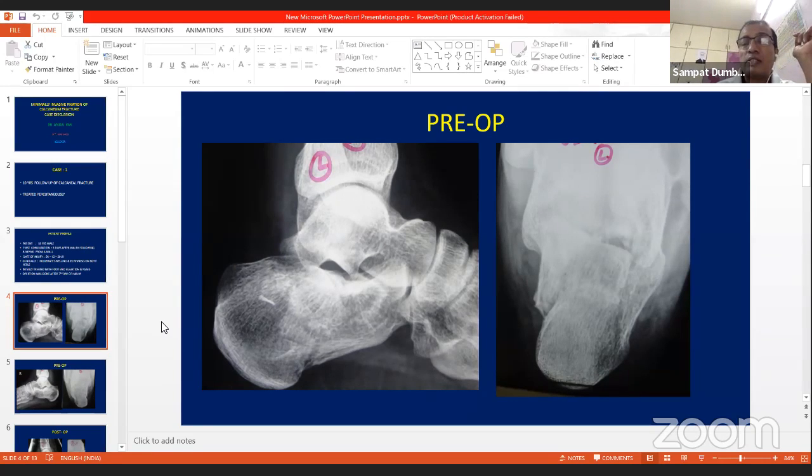Now see here, the heel is in varus. Fairly good articular alignment, as seen in axial. So our aim was to first bring him out of varus, gain the length. I would just put a K-wire medial to lateral or axial, pull it into good axial alignment, and then as he has done with a few screws, or I will even pass some transarticular wire, whatever way you are comfortable, but reasonably good job done since he is young.